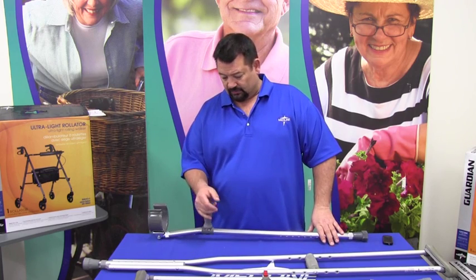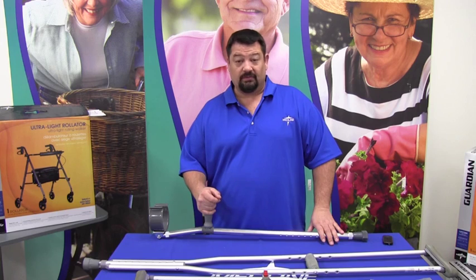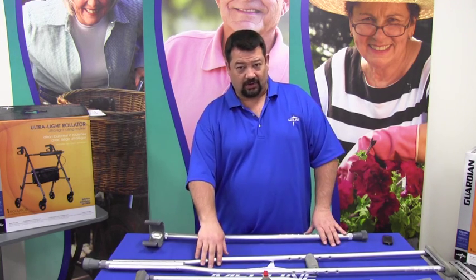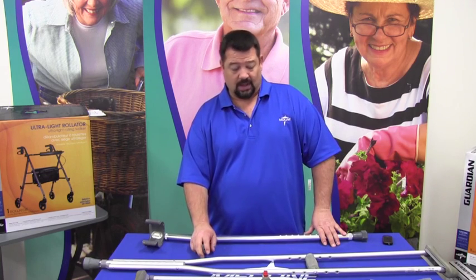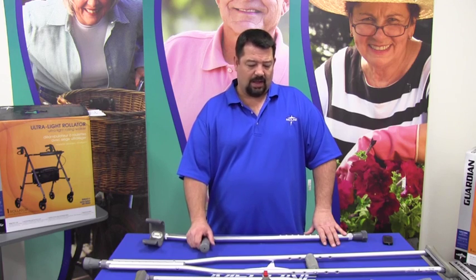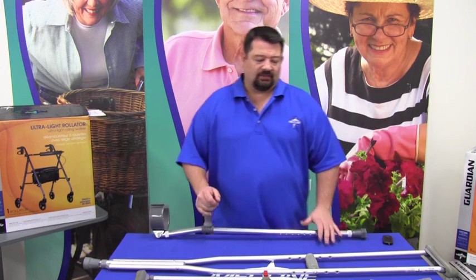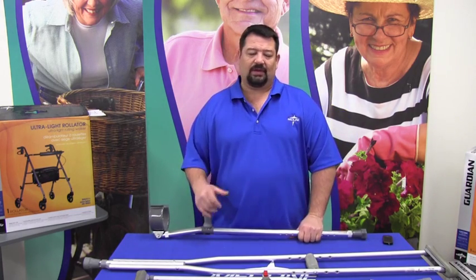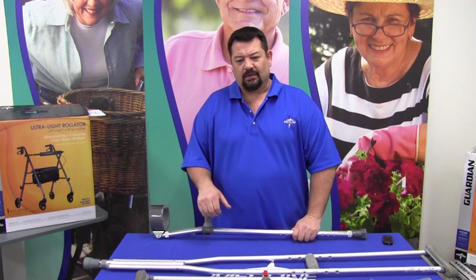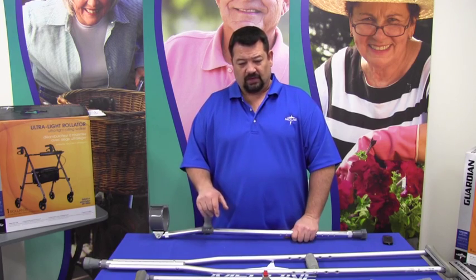A forearm crutch is designed for someone who is going to be on crutches a very long time. These are long-term use crutches. Axillary crutches are designed for short-term use, anything 3 to 6 months tops. The forearm crutch is designed for long-term use, for polio and a couple of other diseases that cause the need for this kind of crutch.